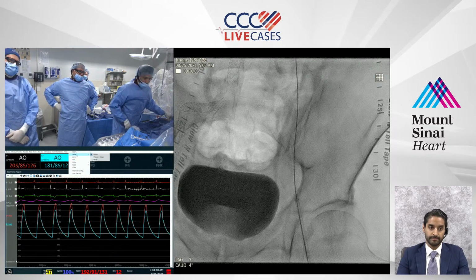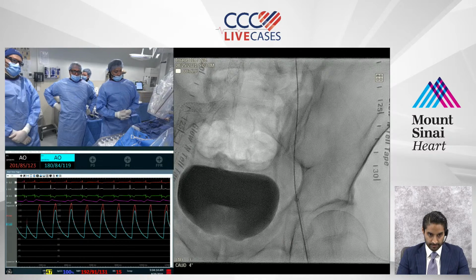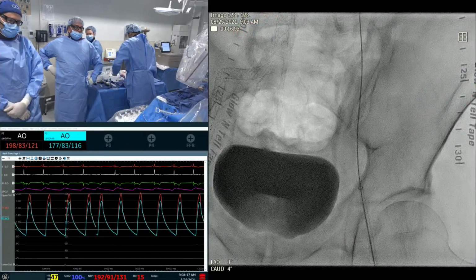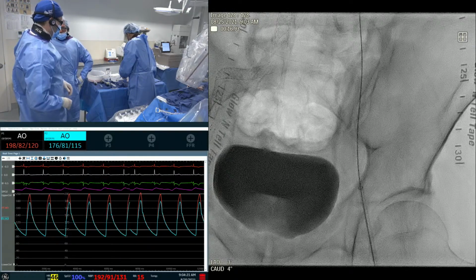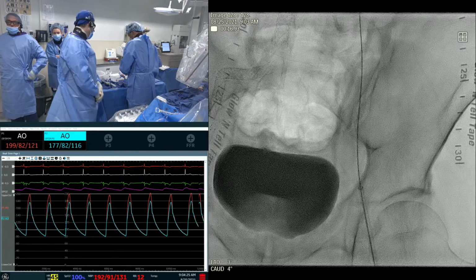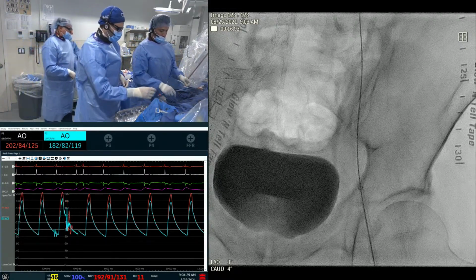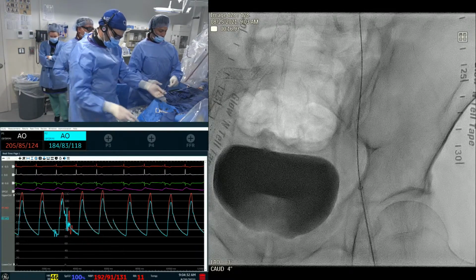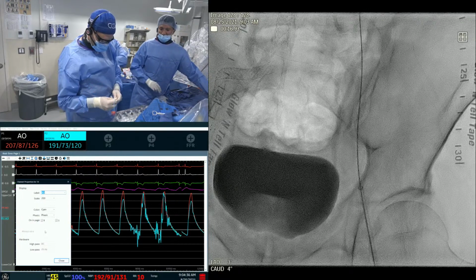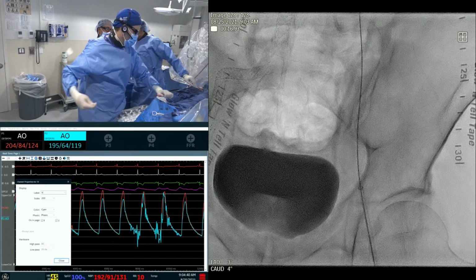So this is what I would do. I would put the dilator into the 7 French sheath, advance the 7 French sheath into the aorta, and do a sheath pullback. So let's do that. They're going to find where the lesion is and identify whether we have to fix the external iliac or not. Elizabeth's worried about his pressure, but at this stage, let's do the gradient first, and then we'll give him hydralazine. So this is going to tell us whether it's in the stent, whether it's in the ostium or not, and then we'll take it from there.